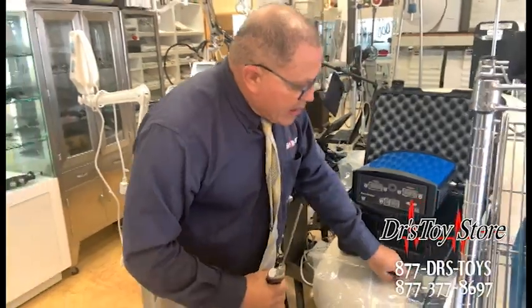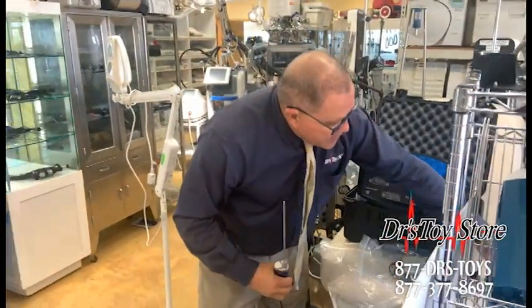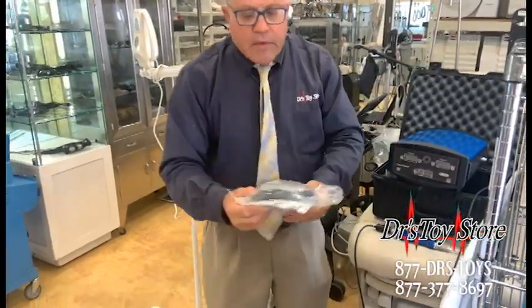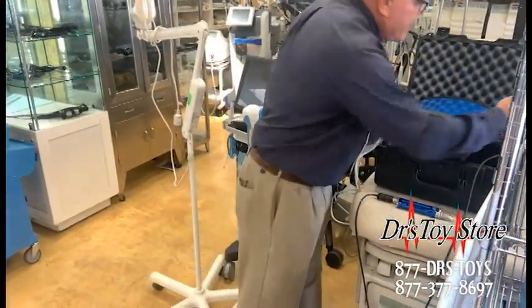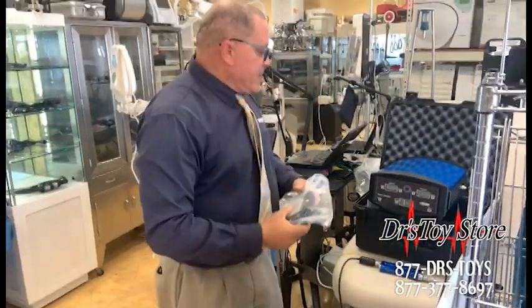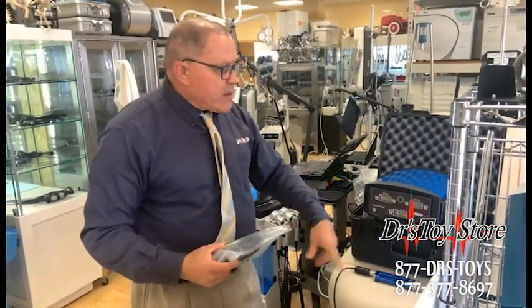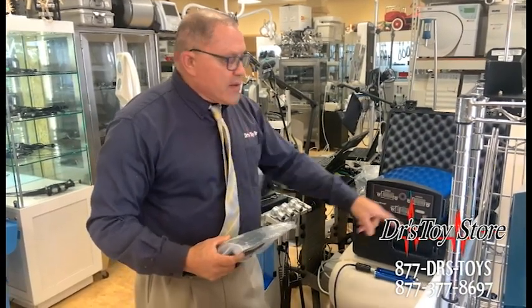You take your foot pedals — the foot pedal goes right in the side, push it in right there. Turn it on, and you do either manual on or foot pedal on. Then you have your speed and your angle.